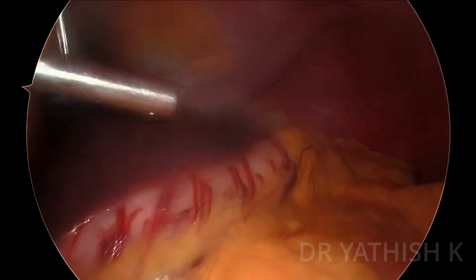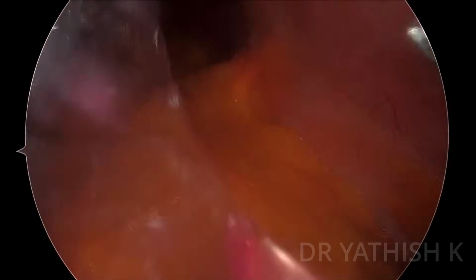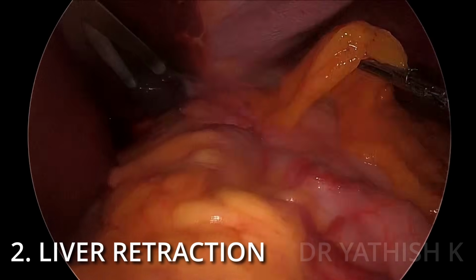So basically, the aim of Heller's myotomy is straightforward, where we have to divide the muscle fibers of the lower esophageal sphincter and create basically a low resistance pathway for the food bolus to pass. So let's go through the operative video step by step.